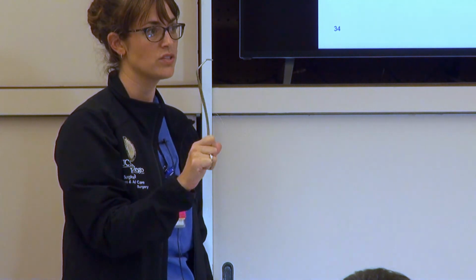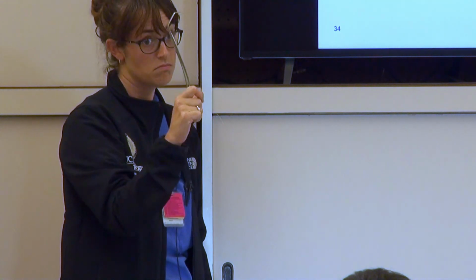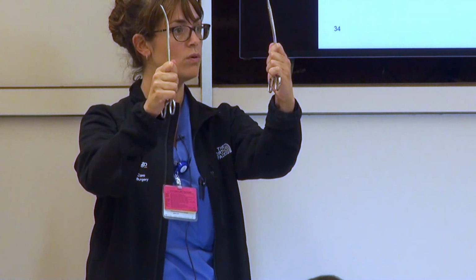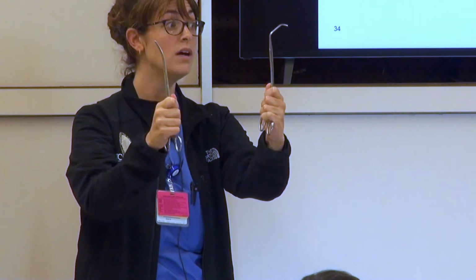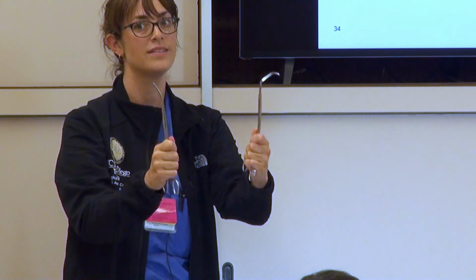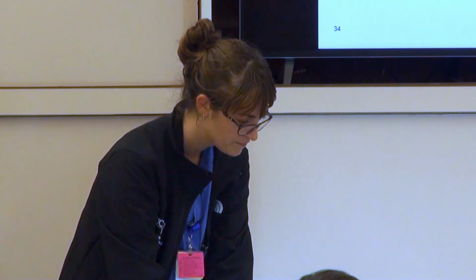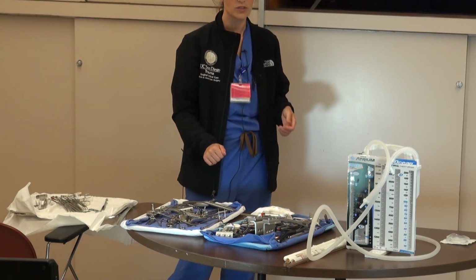I know there are a number of attendings who prefer this. Kobayashi is one of them. Kobayashi knows her stuff. I like her very much, and that's why I started using this after working with her, because I find it much easier than using this. So they may ask you for that. Either of these will work, and if you have your gloves on, you can help hand things off, because the residents may not know, probably won't know, okay? And you will be a much better resource. Is that on the open chest tray? Yeah, it's on the open chest tray.